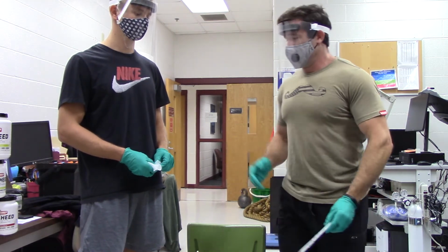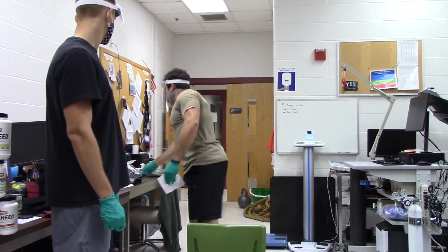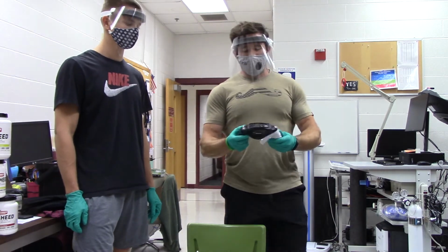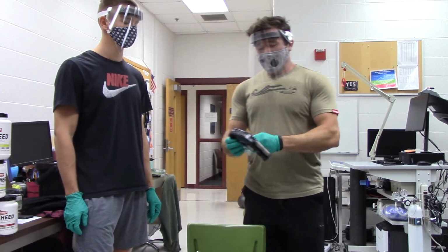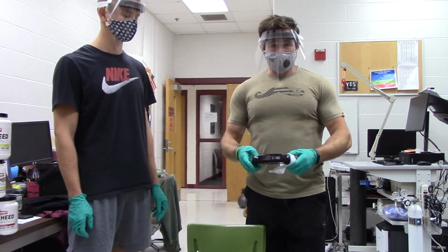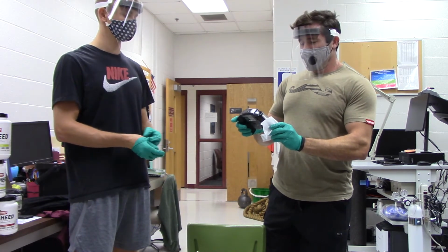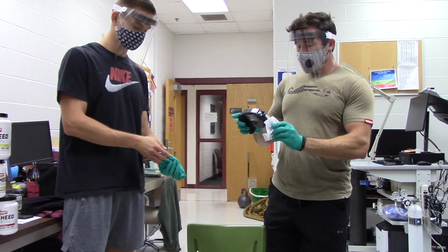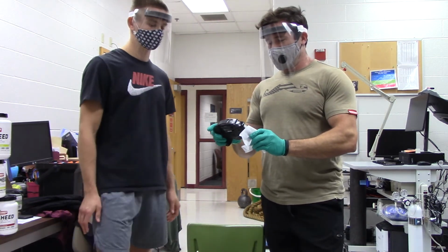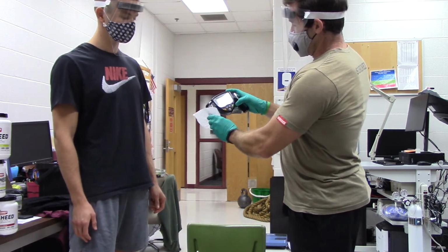Now, after we've done all those, we're going to go ahead and hand on over, and we're going to use the Omron body fat monitor. We're going to wipe these things down before we use them, and we will then have to take off our gloves. I'm not taking off my gloves, but you're going to, from there, actually, yeah, if you want to, that's okay. So, we're going to hit him as normal. Yehor is 6'2". So we're going to go ahead and change the numbers until we get to 6'2".